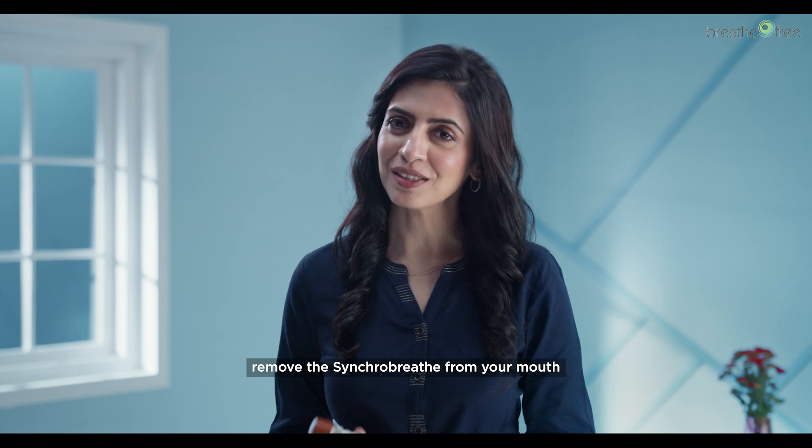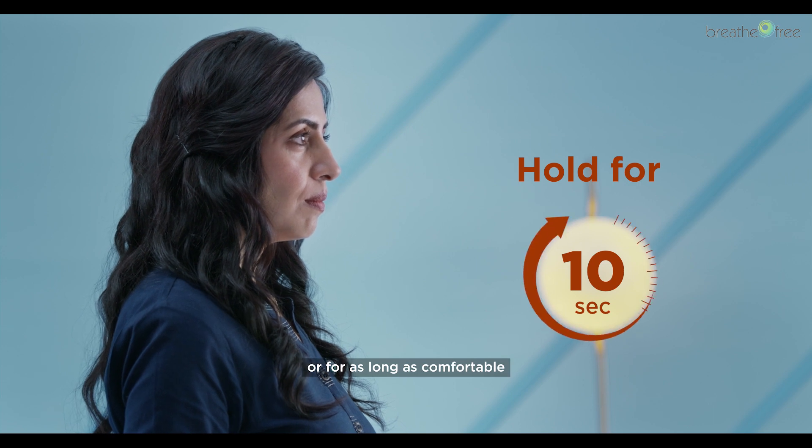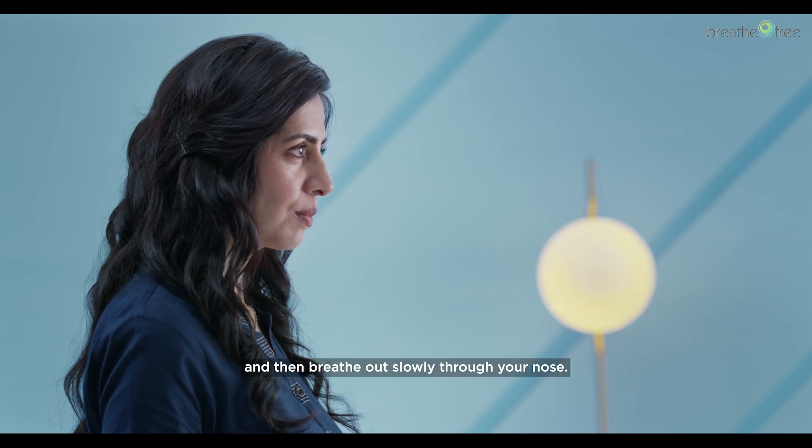When you are done, remove the SynchroBreathe from your mouth and hold your breath for 10 seconds, or as long as comfortable, and then breathe out slowly through your nose.